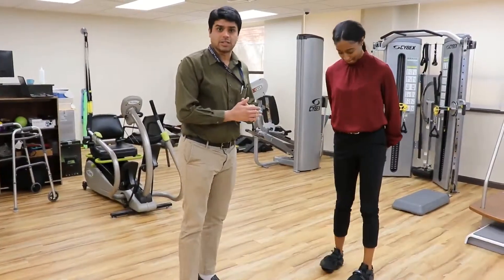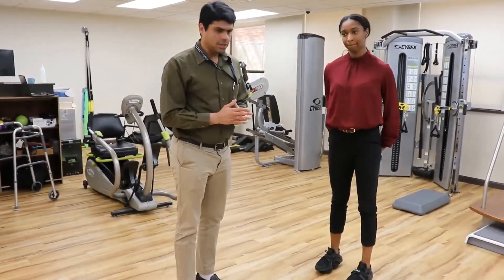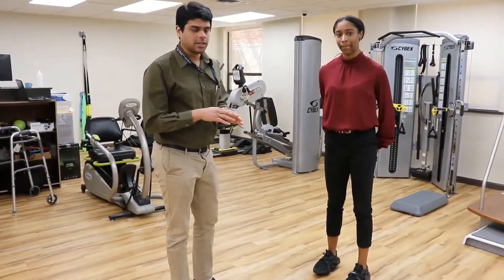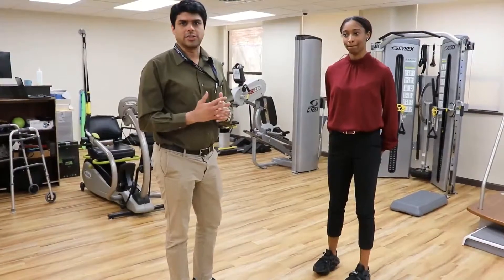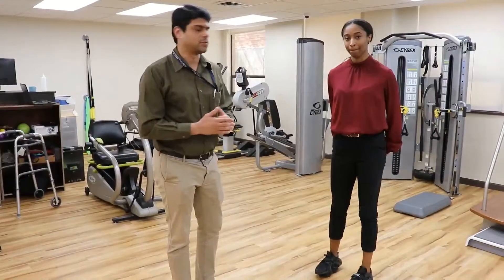We were actually just using this before we started filming the video. We had a walk and run with this and she said it actually forces you to walk and run in the correct manner and can be quite challenging — a little more challenging than just walking on the normal floor.